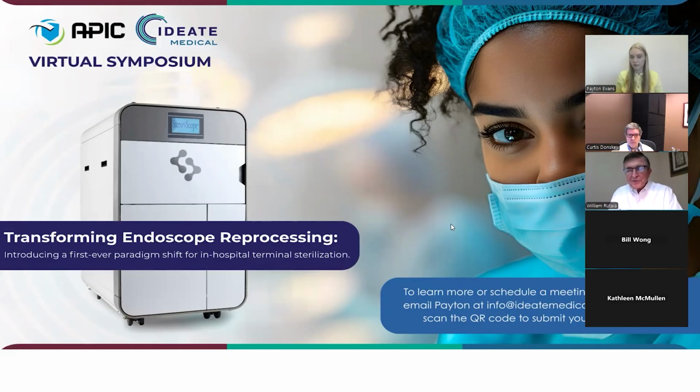It has to be, for example, the sterilizer having validation from the FDA without having validation from the endoscope manufacturer. Because as you can imagine, sometimes there's a conflict because the endoscope manufacturer may have a high-level disinfection automated endoscope reprocessor that they may favor for reprocessing their scopes. So it's sometimes not in the best interest of the endoscope manufacturer to accept other technology. So it's been circumvented by ANSI, AAMI, and the new SHEA guidance document using that verbiage.